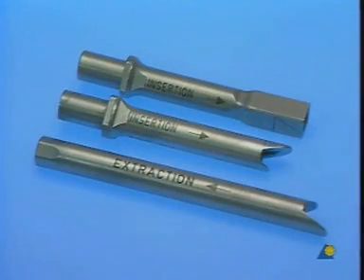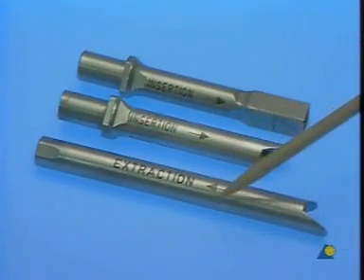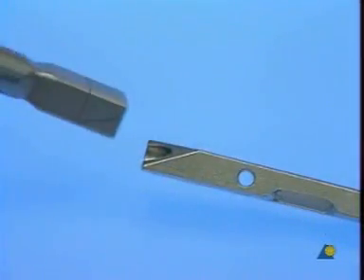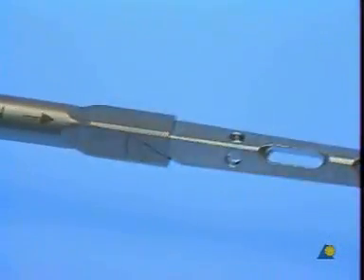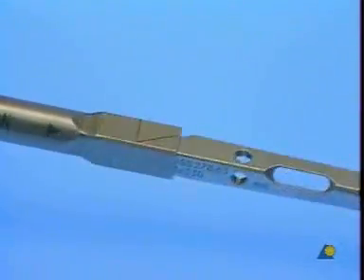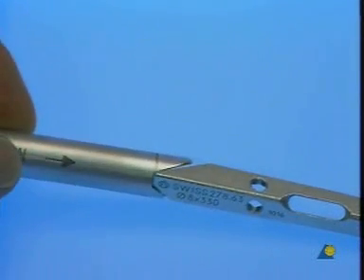To mount the insertion instrument on the unreamed tibial nail, three attachments are available. Two of these are used for insertion of the nail, the third only for extraction. The attachment with the right-angled sleeve on the front covers the proximal end of the nail, creating an optimal connection between the intramedullary nail and the insertion assembly.